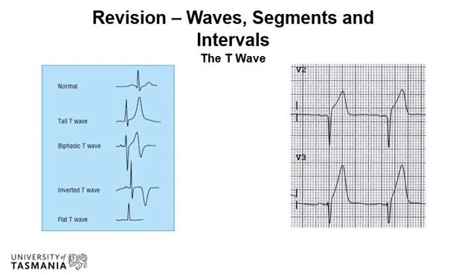Some possible causes of T wave changes include infarction, hyperkalemia, persistent juvenile T wave pattern, myocardial ischemia and infarction, bundle branch blocks, ventricular hypertrophy, pulmonary embolism, hypertrophic cardiomyopathy, and raised intracranial pressure. The ECGs above show hyperacute T waves, and these changes are normally associated with an early anterior STEMI presentation.